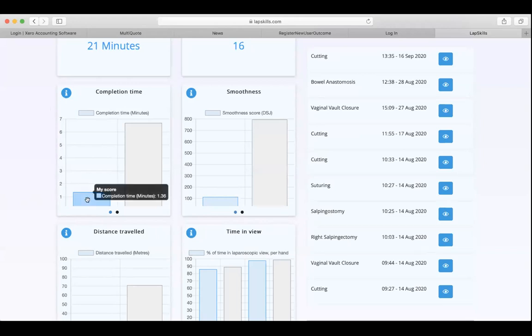And here you can see an average score, and that's compared to the average score for everyone in the platform. As time goes on and we have more users globally, please note that this was launched in July of this year. So as we gain more users, we will give people the option to compare not only to the global average, but much more distinct averages.